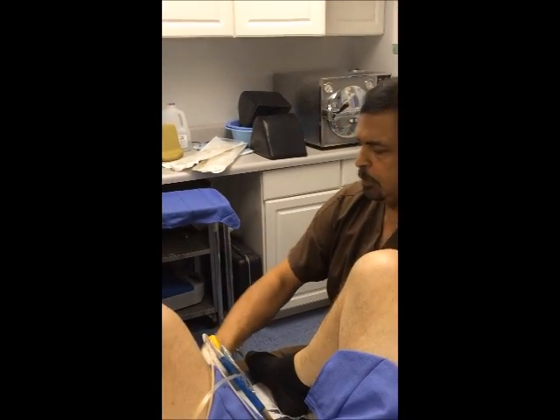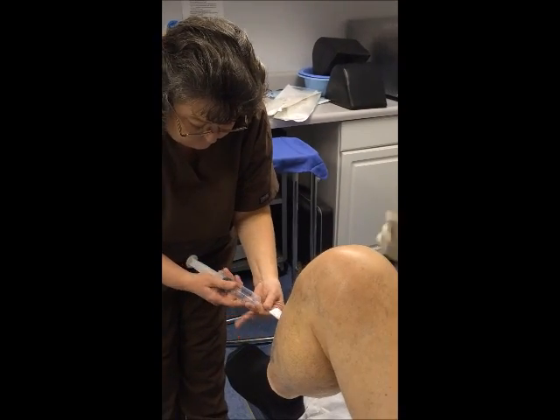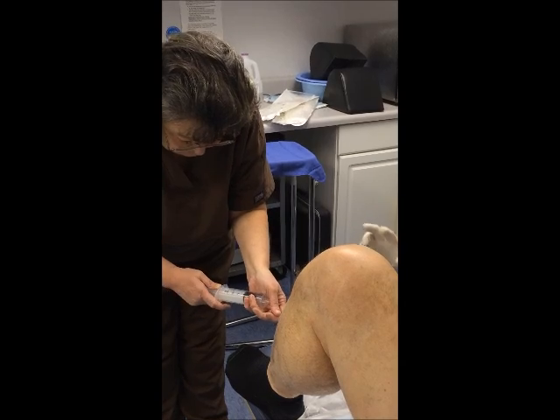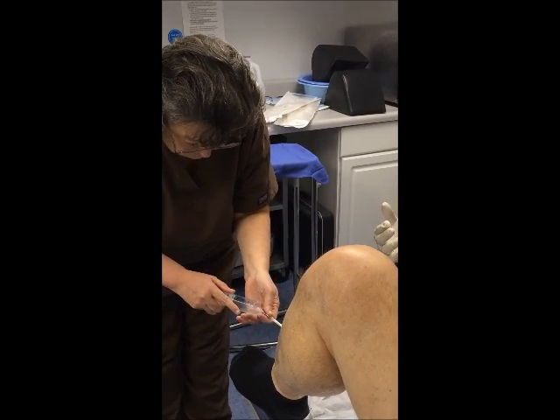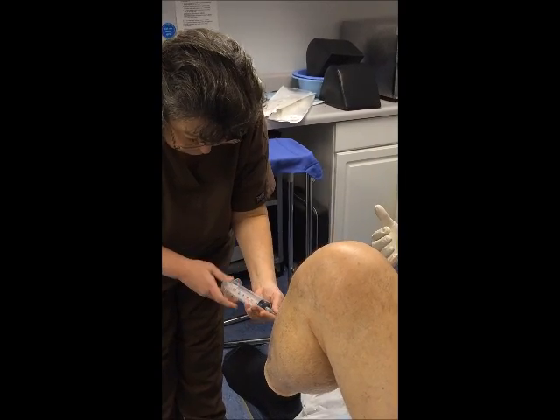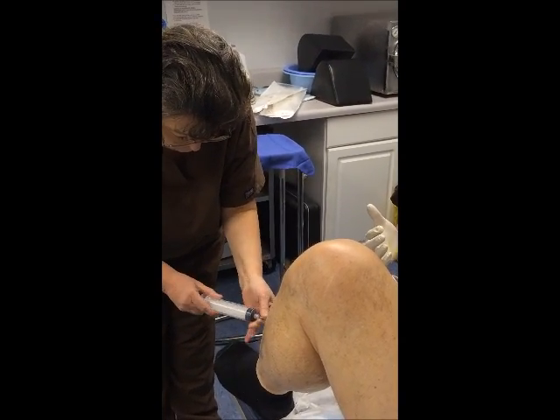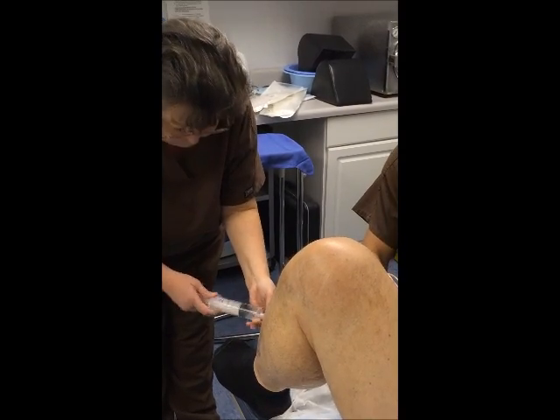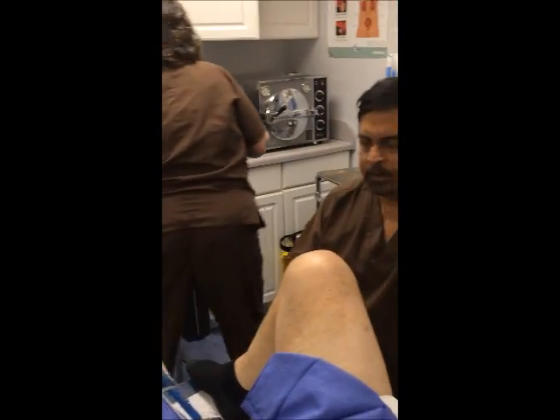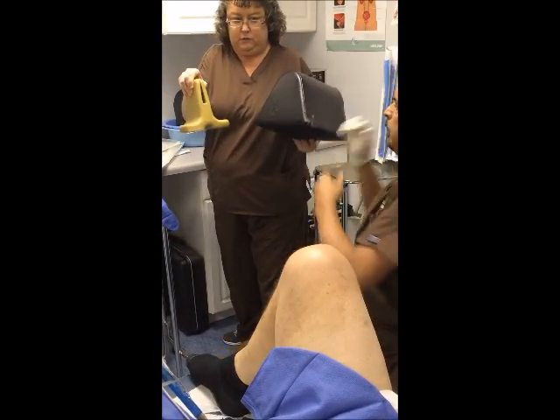My assistant puts 90cc of air — 60 and 30 — then takes out 20cc to keep a total of 70cc in the balloon. Next, we take what's called a comfort pad so the patient can very comfortably undergo the procedure.